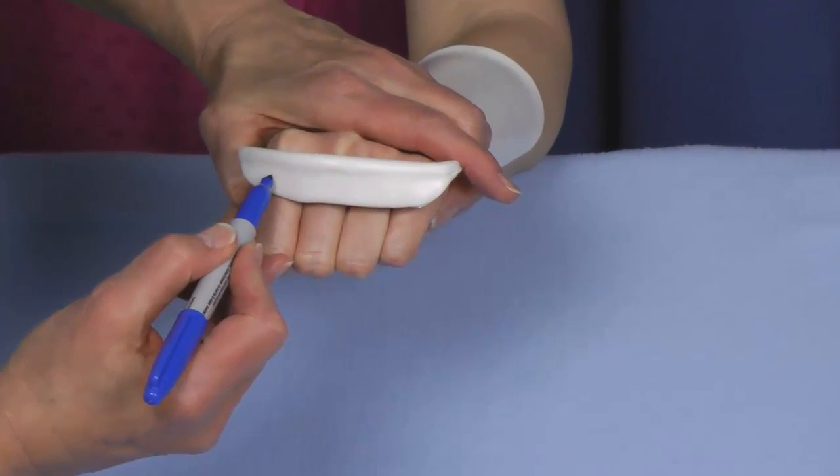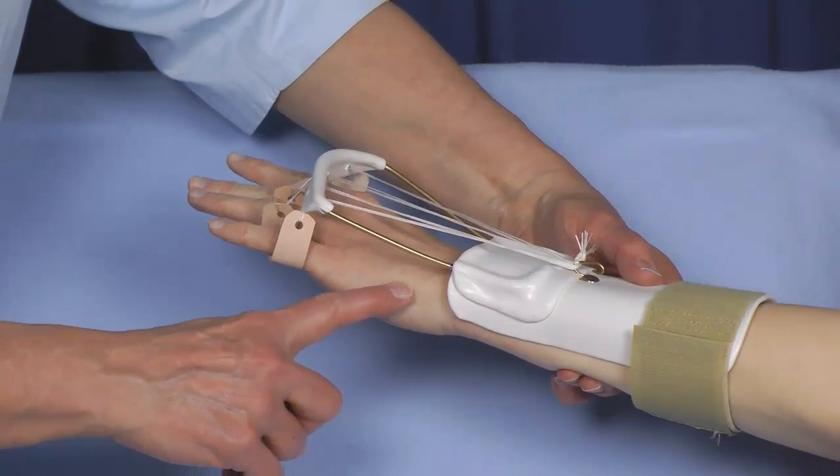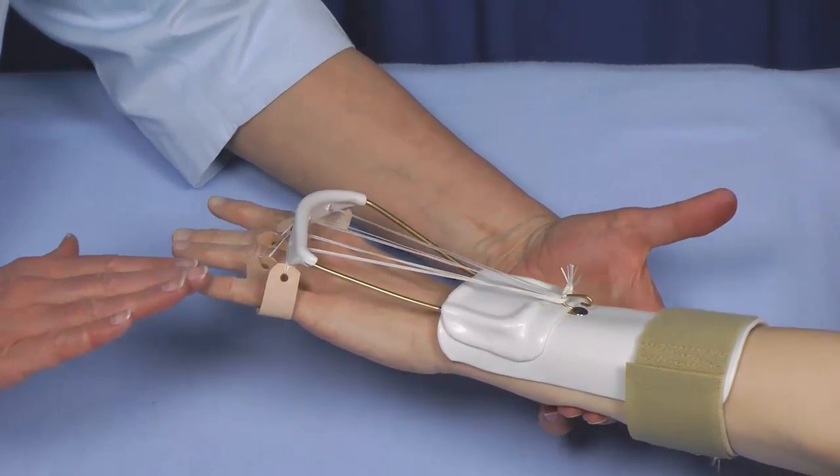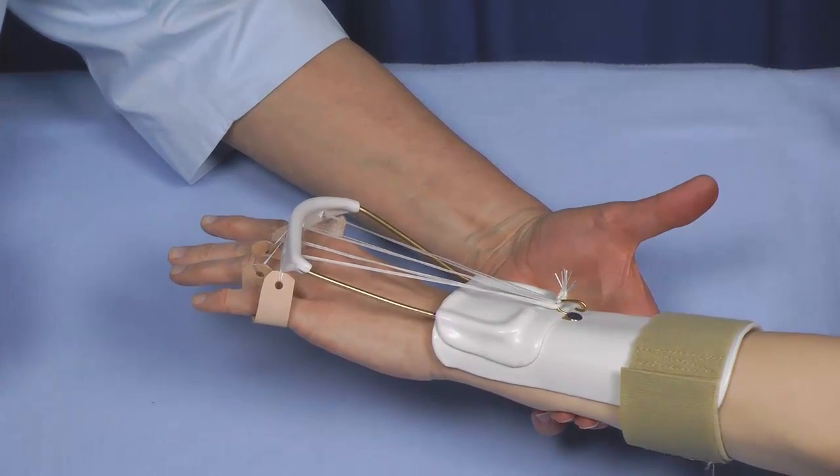I mark exactly where the middle of each proximal phalanx is. The wrist is about neutral and she's fully extended — remember her intrinsic muscles are extending her fingers and she's now able to make a full fist.